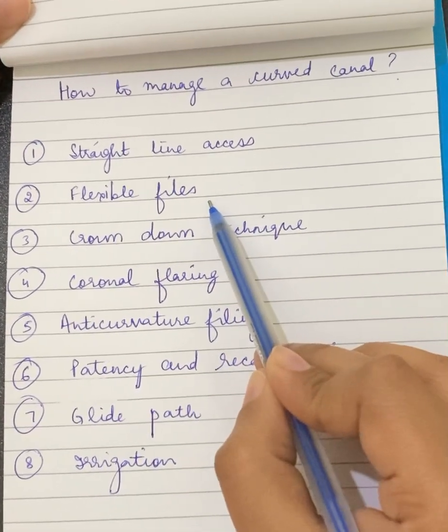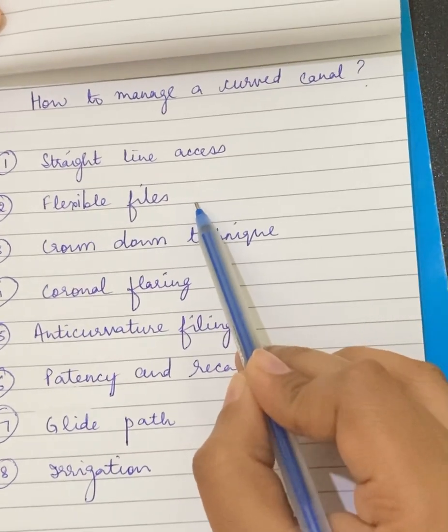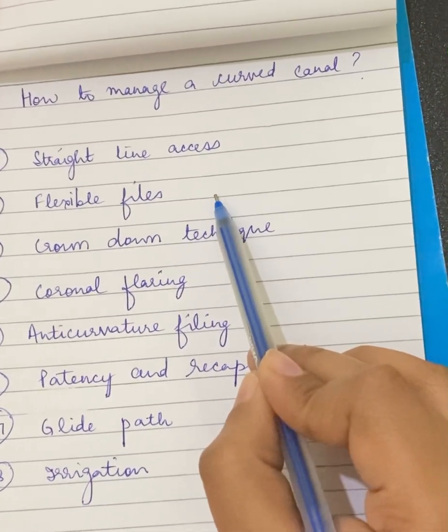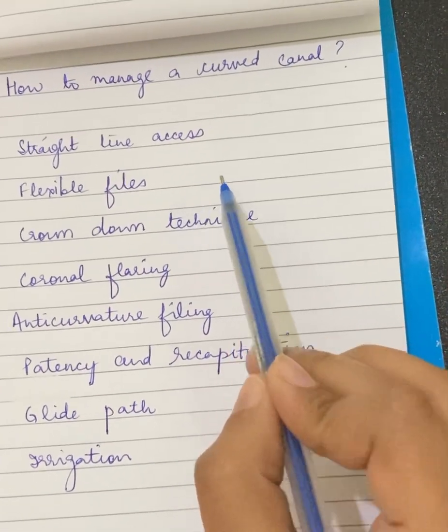Secondly is the use of flexible files. Small number flexible files, number 8 to 10, should be used initially, and they should be nickel-titanium files because they are flexible. Stiff stainless steel files in such cases should be avoided.